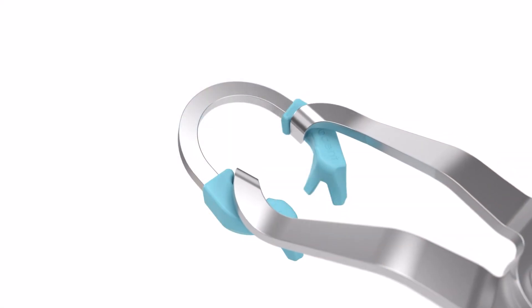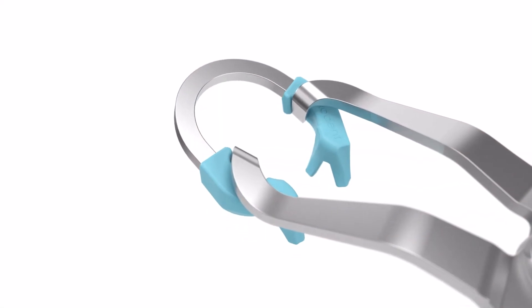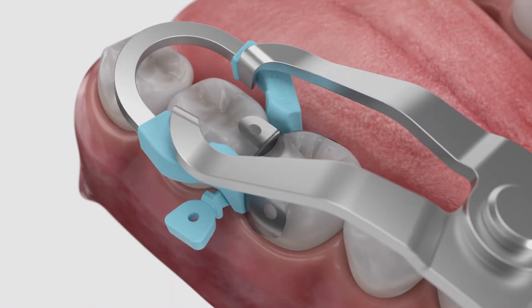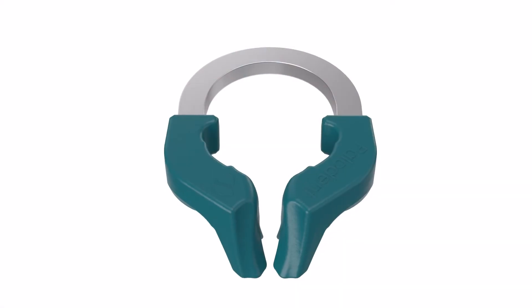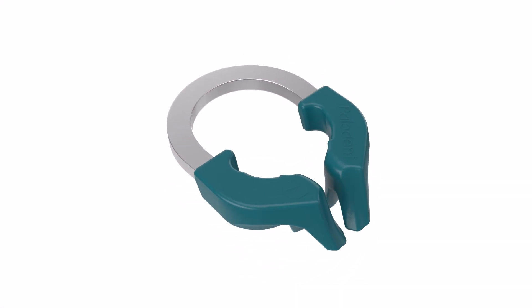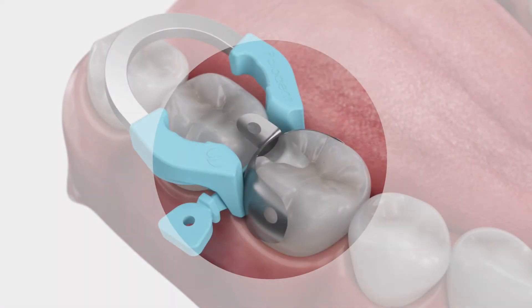After placement of the Wedge, load the Paladin V3 ring in the forceps. Be sure the ring is fully seated as shown. If performing a restoration on a small tooth or premolar, you may prefer the Paladin V3 narrow ring. After placement of the ring, check the contact to the adjacent tooth.